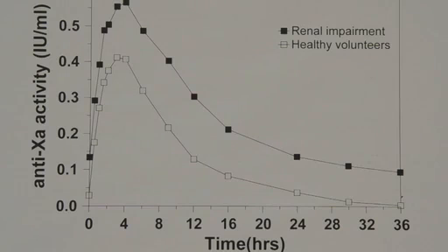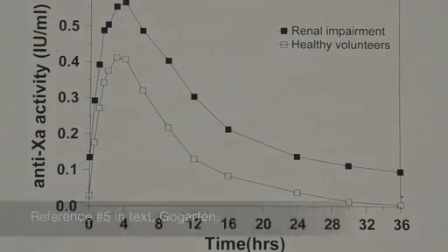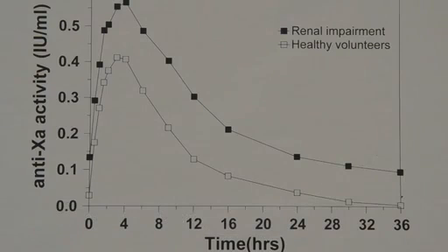A point of particular interest also, however, is how much remains 12 hours after administration, because there is a guideline that is clinically accepted that one should wait at least 12 hours after the administration of low molecular weight heparin, in this case enoxaparin, before doing some particularly invasive procedure which might result in a risk of bleeding. It is of interest to us that there is still a clearly detectable amount present at that time, and we have focused on that in some of our studies, as we will demonstrate.